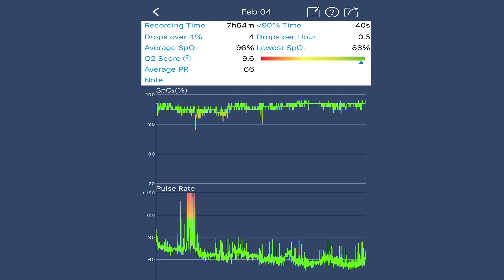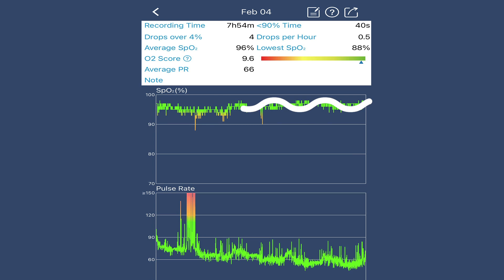But it was only the one time during the night, but you can also see a few other little spots here where I sort of dipped into that orange zone and that would have also been probably REM sleep when I was dreaming or maybe perhaps when I was on my back. But look, overall, if we go sort of from the start to finish, most of it's in the green there. And if we go to the stats there, you can see here that at the very top, it says the amount of time below 90 and that was only 40 seconds. So 40 seconds of the whole night below 90%. So I'm pretty good. I'm in the clear here.